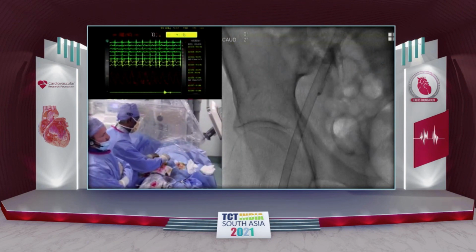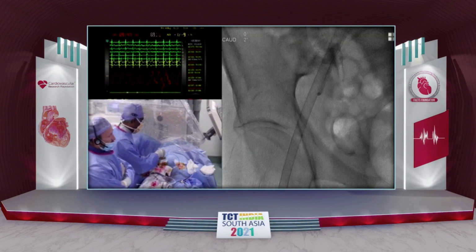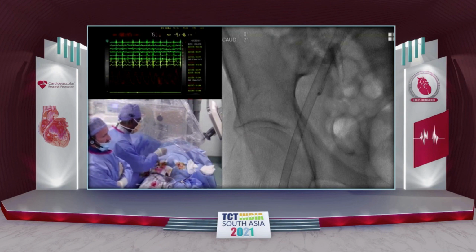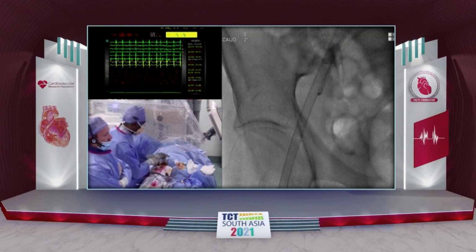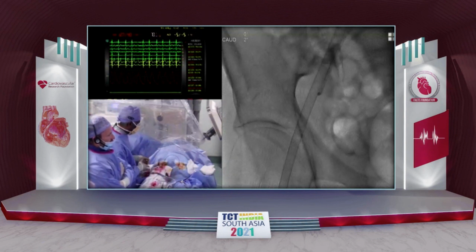And now I think with our more novel implantation techniques, we're all starting to achieve lower pacing rates. And then the third point of why I would use a Navitor valve over an Evolut would be for coronary access in lower to intermediate risk patients. So I think those are the main features of the Navitor valve and its positive aspects, and why you would choose it.